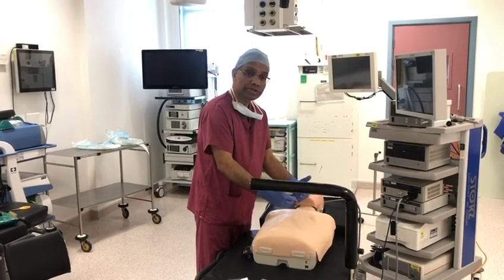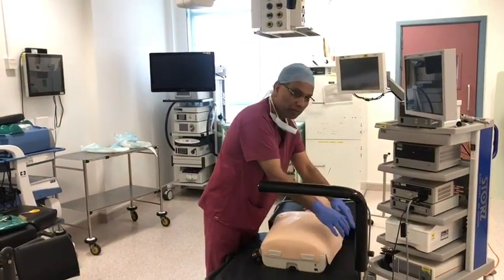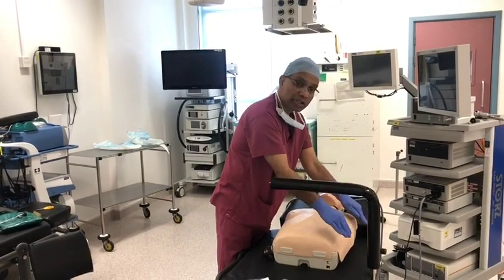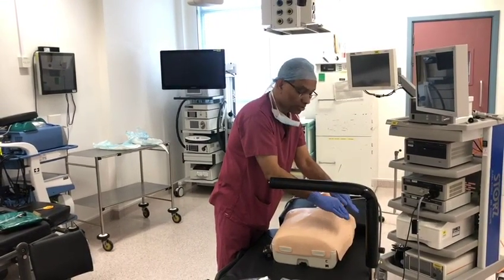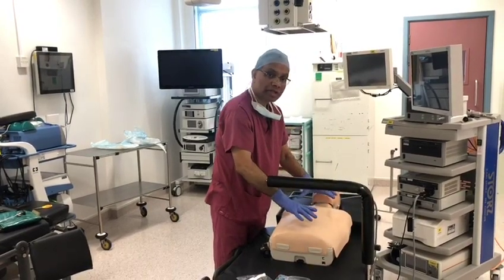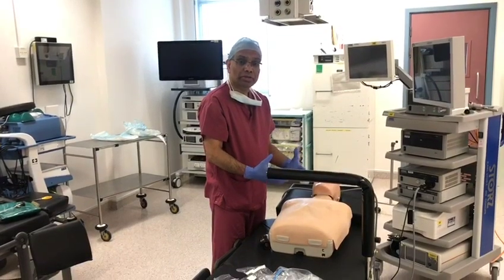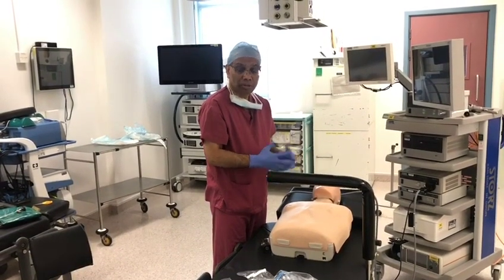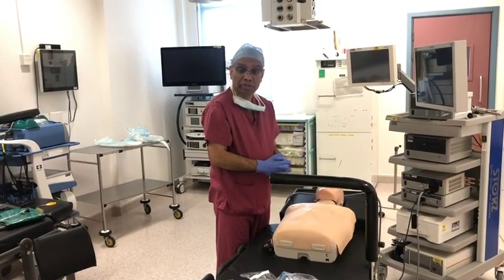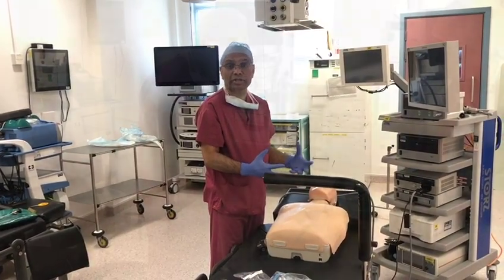You can also use the bipolar sleeve by the side of the table, which has three pouches. You can use the micro-debrider, the bipolar in those pouches, and the instruments are here. We are limited in how many instruments we can use, but remember, this is an emergency sinus surgical procedure and not a routine extensive sinus surgery.